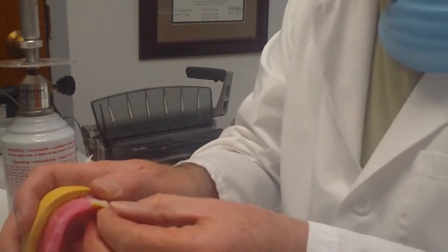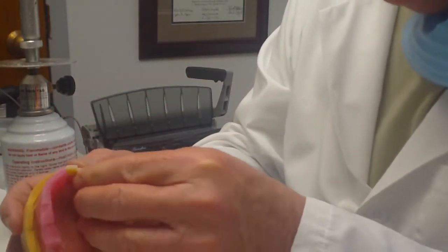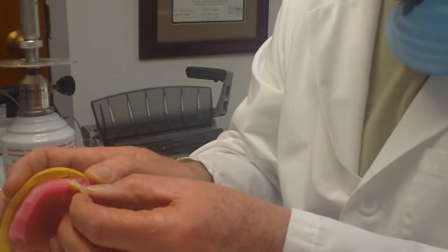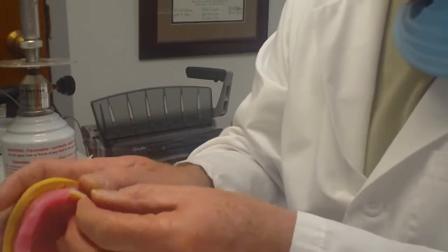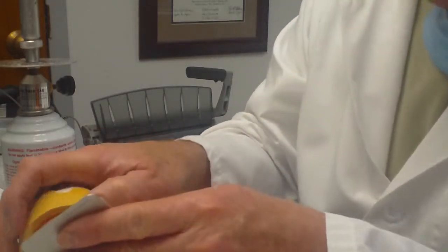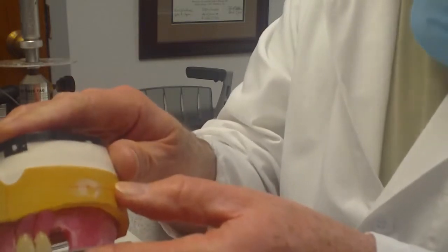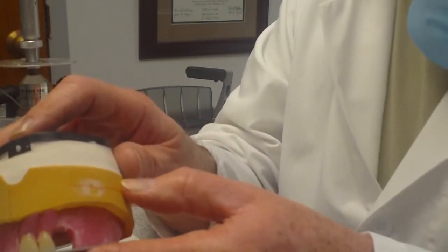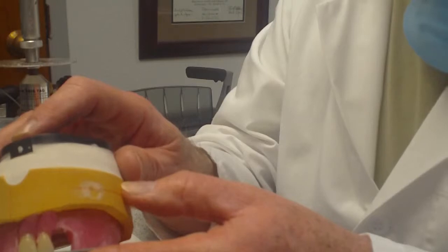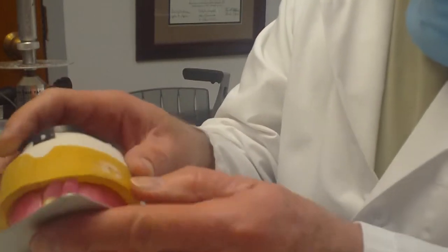So again, positioning the tooth, I'm kind of guesstimating as I look to the opposite side where the arch or arc of these teeth are going to be in the setup. We want to have the necks of the teeth in and the incisal edge out toward the occlusal plane. And if you notice, I've made the lateral incisor just slightly short of this occlusal plane that we've established, so it's about 1 millimeter short. And in general, in an unworn dentition, this would be considered an aesthetic and an appropriate positioning of the lateral incisor.